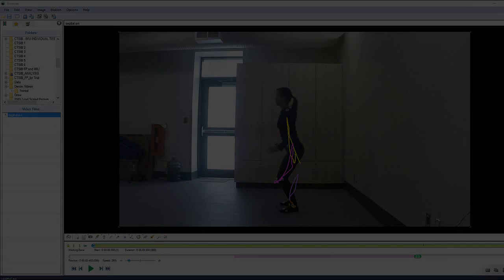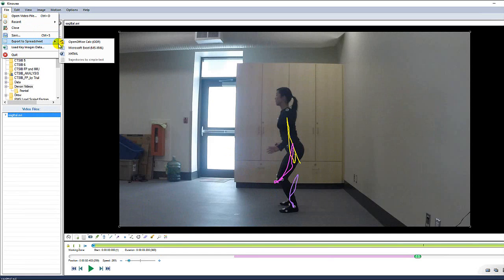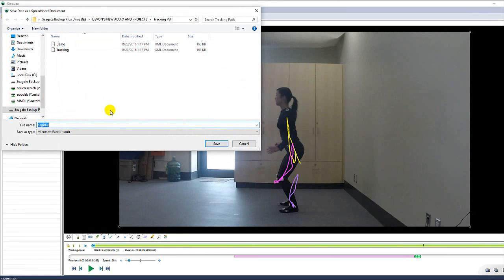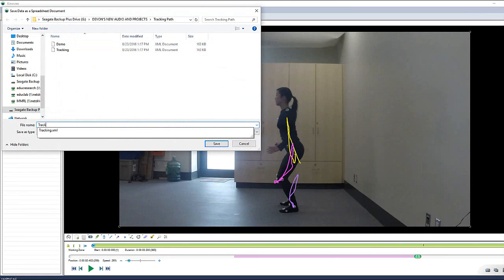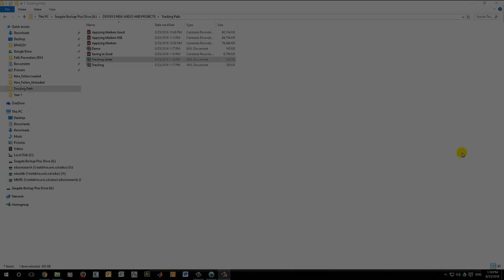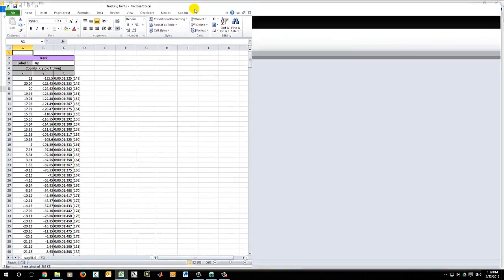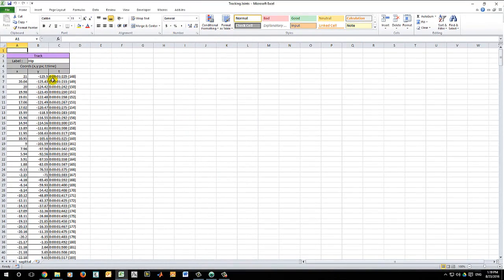You can now export the data to an Excel spreadsheet. Hit File, Export to Spreadsheet, Microsoft Excel. Kinovea will export this file in a .xml format. So the next step is to open up the Excel sheet, rearrange the data and save the file as a CSV.